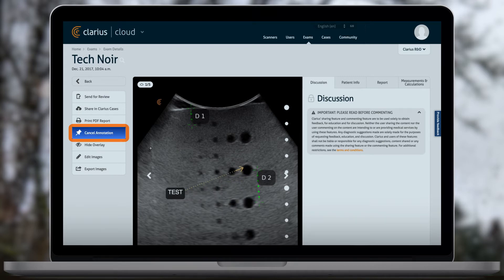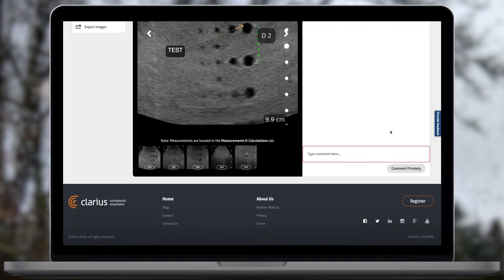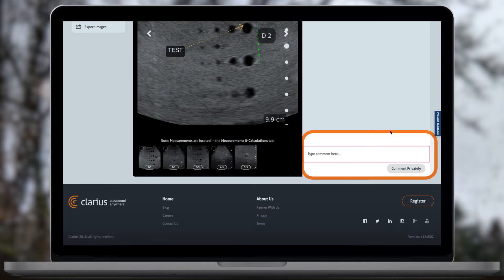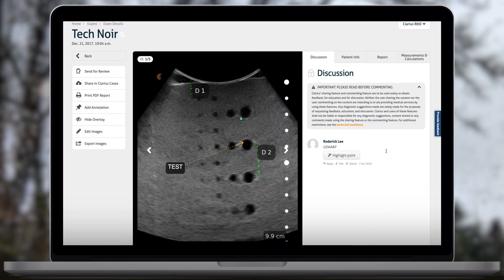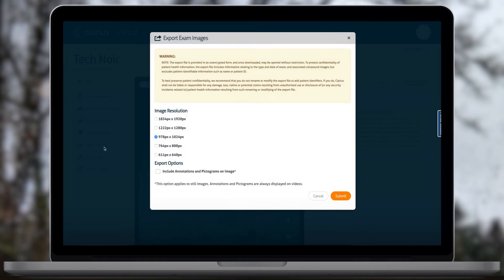You can also add longer comments by clicking Add Point. These will be displayed on the image as a point and will reference a comment in the discussion section. If you use other medical systems, you may need to import your Clarius ultrasound data into those systems. You can choose your desired resolution and whether or not to render annotations or pictograms on the exported images.